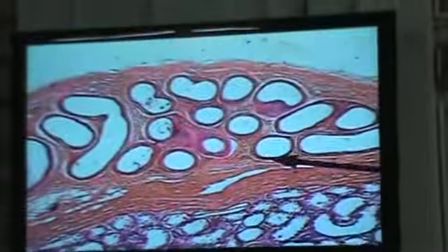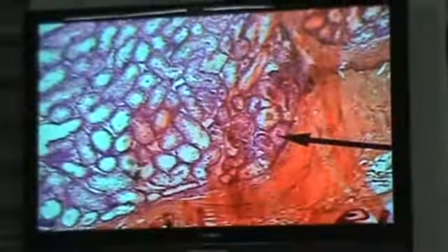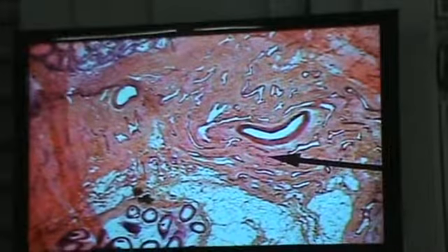So there you see that's the testis with all of its coverings, and that's the epididymis. So if you look at the diagram now, we are leading into the area of the mediastinum testis, and you could think that some of these are the straight tubules.